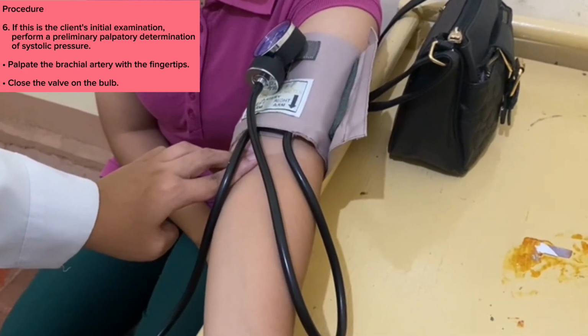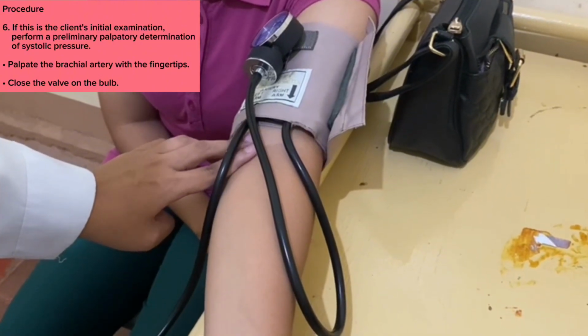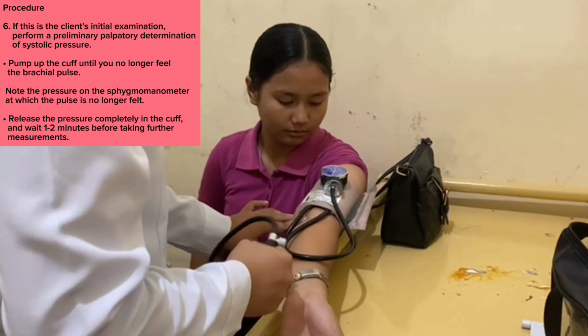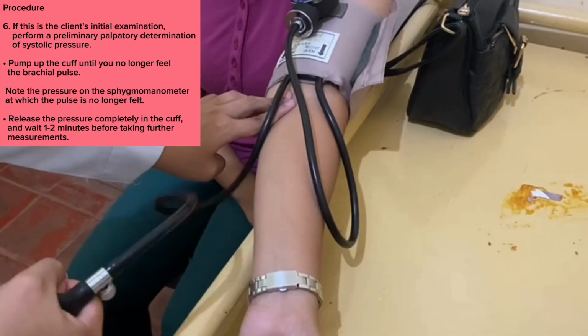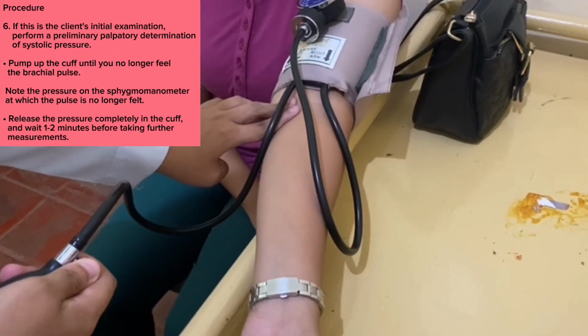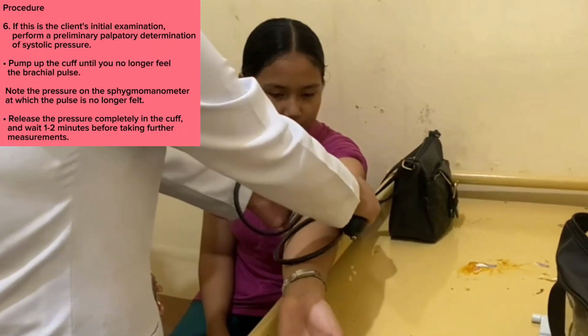First, palpate the brachial artery with the fingertips. Then, close the valve on the bulb. Third, pump up the cuff until you no longer feel the brachial pulse. Note the pressure on the sphygmomanometer at which the pulse is no longer felt. Then, release the pressure completely in the cuff and wait 1 to 2 minutes before taking further measurements.